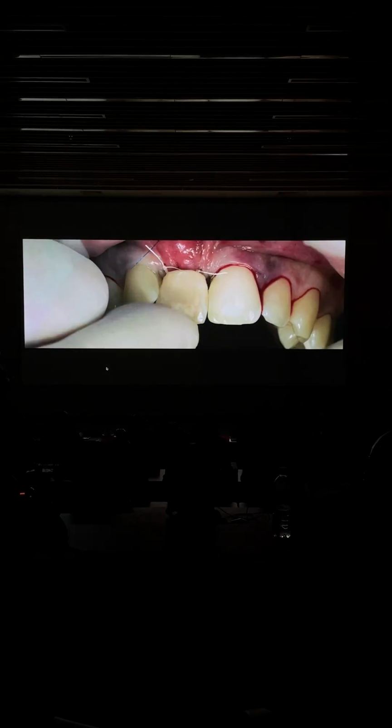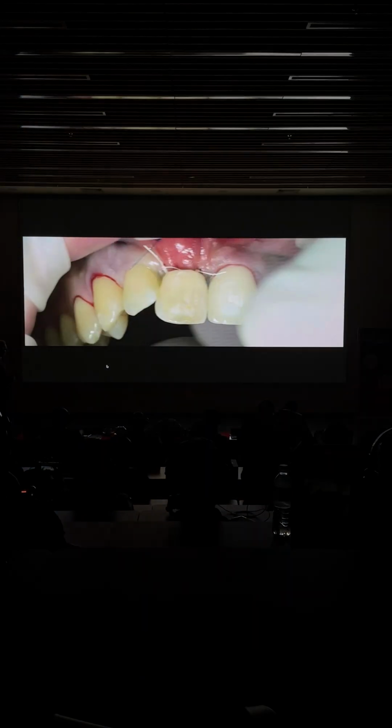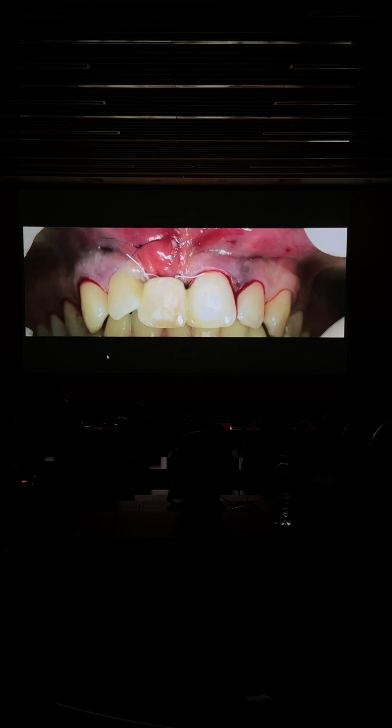Okay, so in this way you don't waste material, and I bond the tooth to the adjacent teeth with composite. Usually I rest on top of the healing abutment, especially if I have enough stability of the implant, of course. You need to understand that it's a totally different concept than in delayed and immediate.